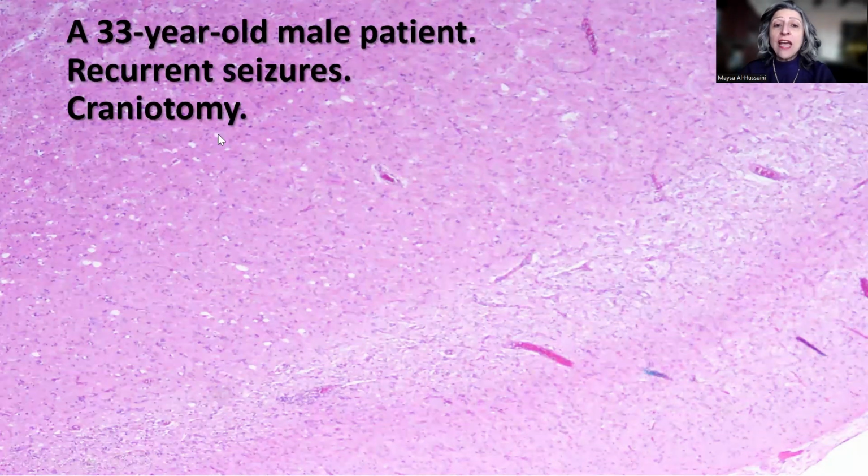And this is actually a generous biopsy from the temporal lobe. As you can see here, this is the cortex. There is some distortion of the cortex here, some perivascular inflammatory infiltrate here, and some pink discoloration of the white matter, for which I'm going to zoom in first on the area here.